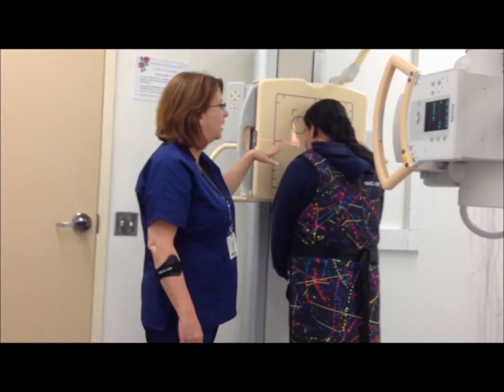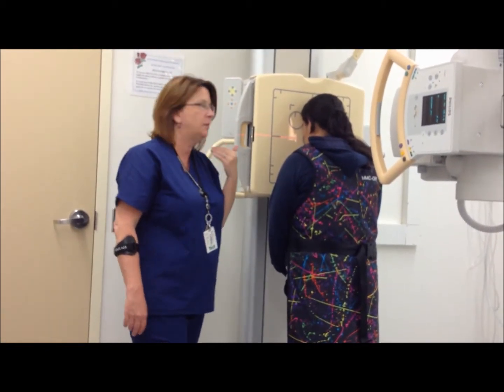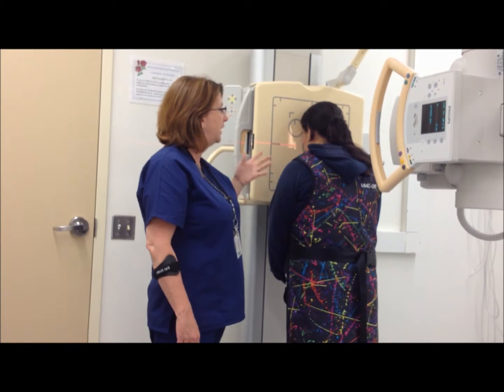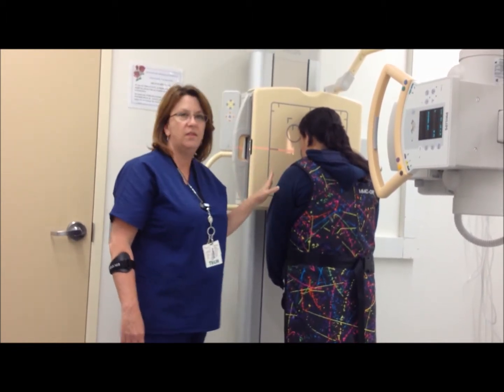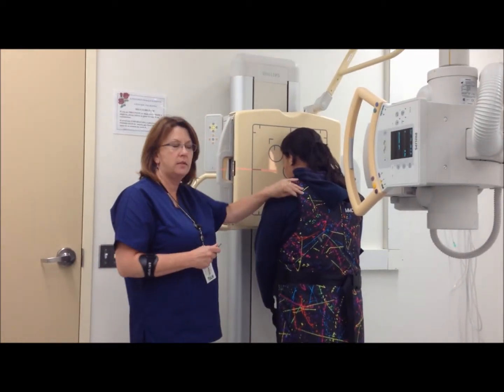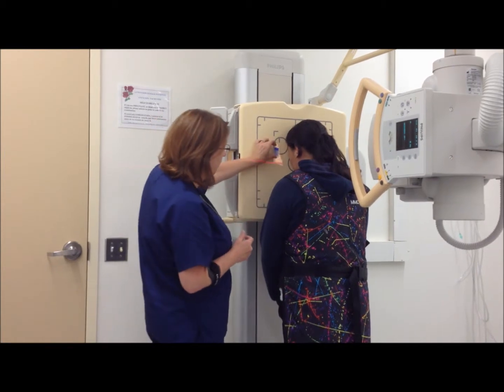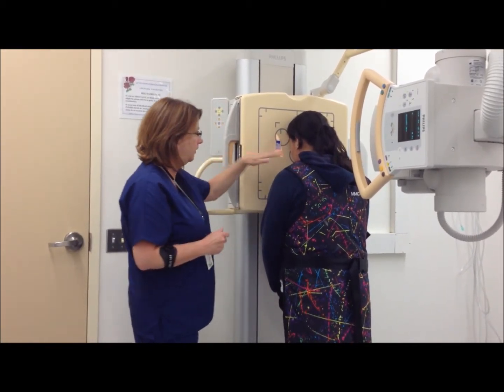This will show the entire mandible, and it will check for any medial or lateral displacement fractures. My technique will be 70 to 75 kVp at 12 to 15 mAs. Okay, patient is shielded, and I will put my left marker on the cassette on the IR in the light field out of the patient's shadow.